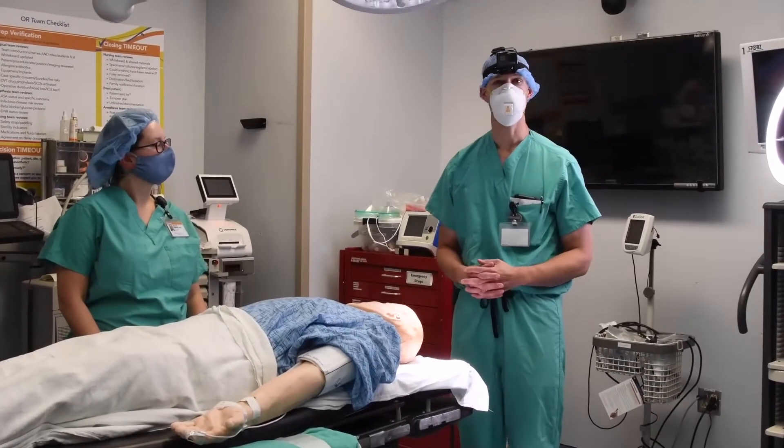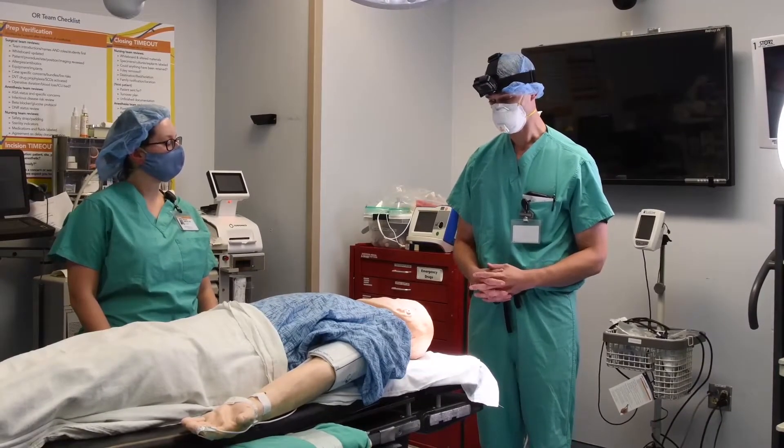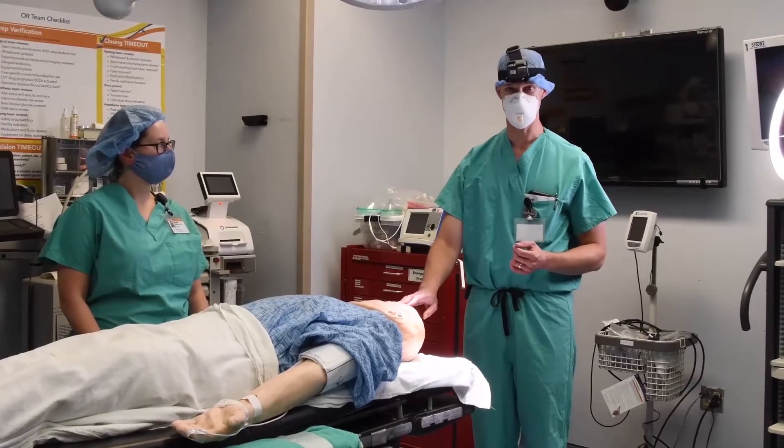The next thing we're going to talk about is pinning for any cranial procedure, but we're going to start with a traditional pterional type pinning. This patient is going to have a left pterional approach for a ruptured left PCOM aneurysm.